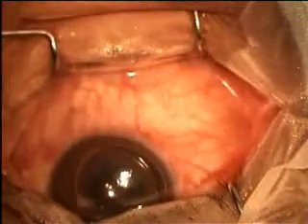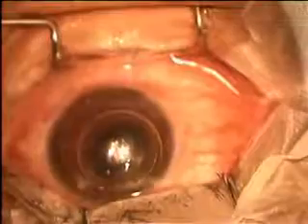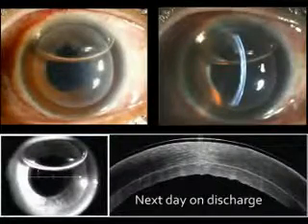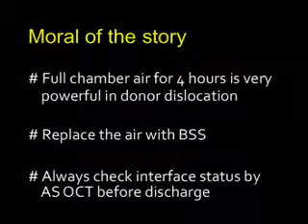Patient kept in supine position for next 4 to 6 hours. OCT image is helpful to find out fluid cleft before sending the patient back. Moral of the story: full chamber air for 4 hours is very powerful to reattach donor button. Replace part of the air with balanced salt solution. Always check interface status by anterior segment OCT before discharge.